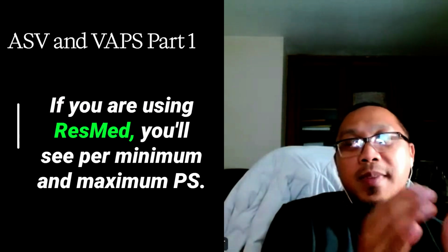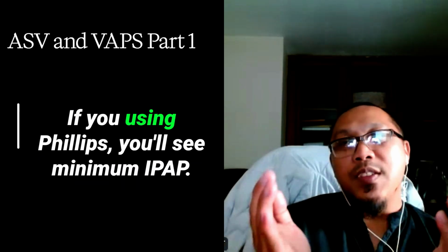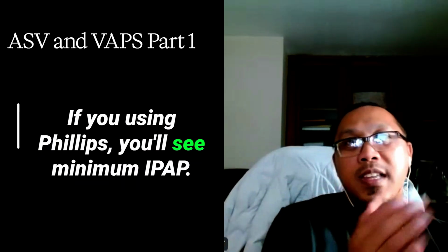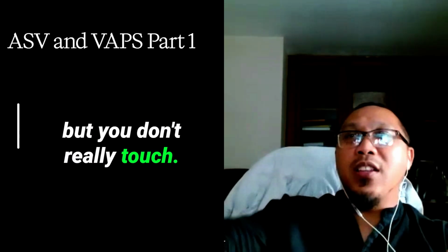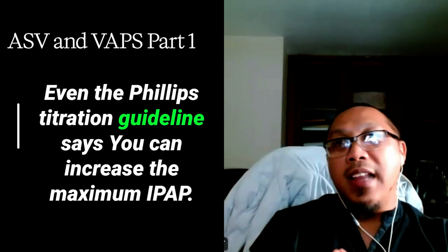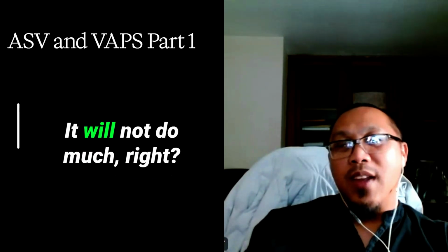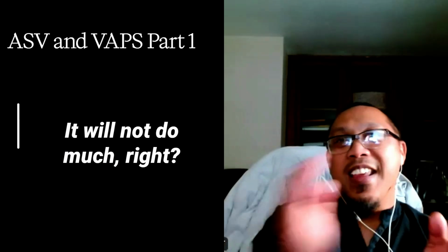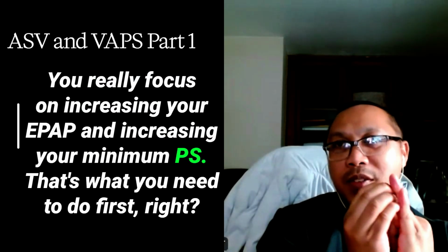If you're using ResMed, you will see minimum and maximum pressure support. If you're using Philips, you will see minimum IPAP, maximum IPAP. But you don't really touch maximum IPAP. Even the Philips titration guideline says you can increase the maximum IPAP. It will not do much. You really focus on increasing your EPAP and increasing your minimum pressure support.